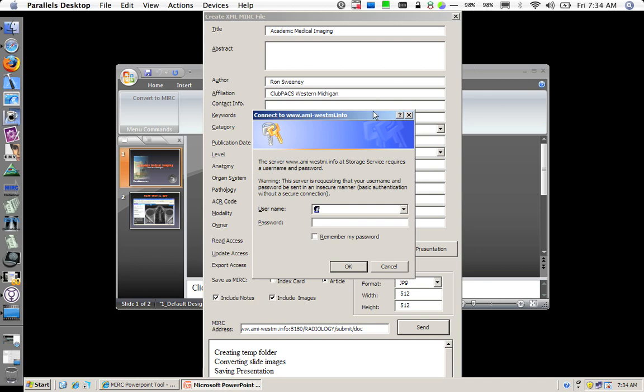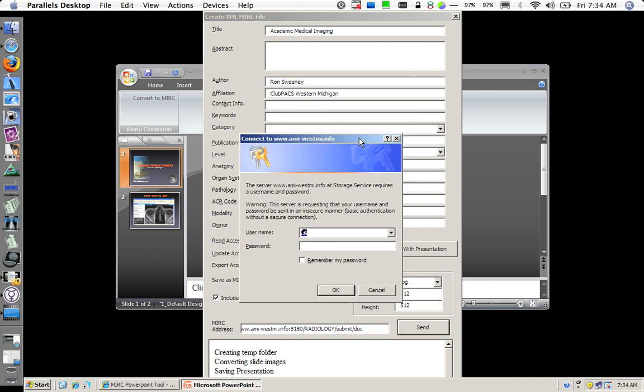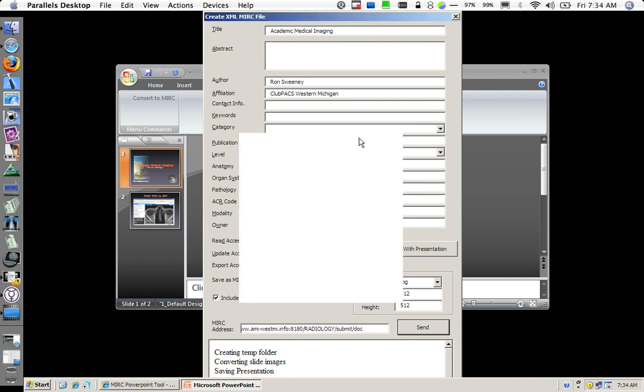Now it has just prompted me for my username credentials for that storage service on my MIRC site. I will supply it with my credentials. Keep an eye on the window down here. It is now uploading the zip file that it created with the XML document and the various images to the site.